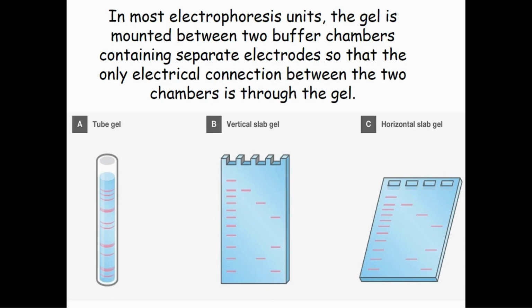This electrokinetic process separates protein molecules or DNA through different procedures depending on the type and size of the molecule. The procedure differs in some way, but all need a source for the electrical charge, a support medium, and a buffer solution.